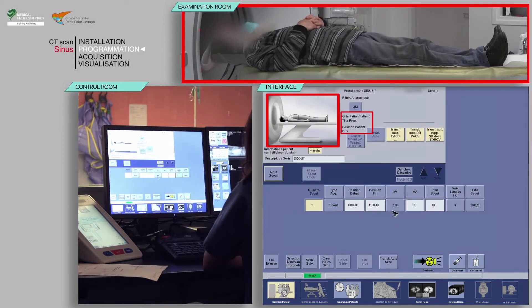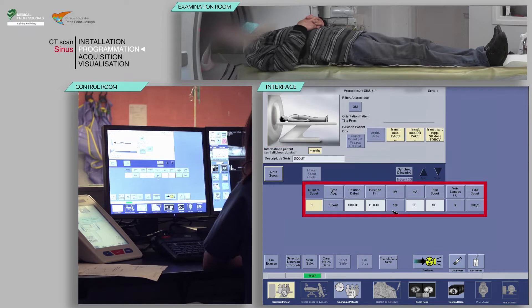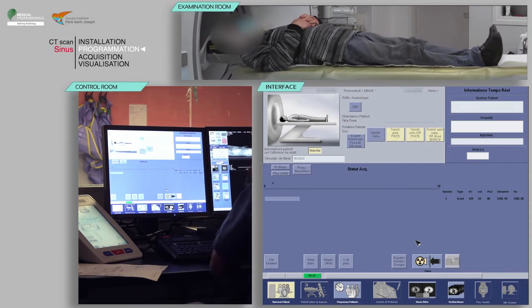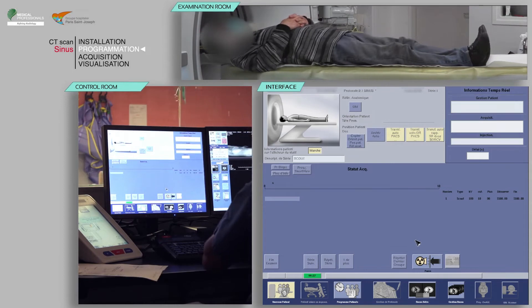Check that the patient's position on the table matches the one indicated. Note that the patient's orientation is head first. After checking the scan parameters, click on Confirm. On the keyboard, move the table and launch the acquisition when the buttons flash.